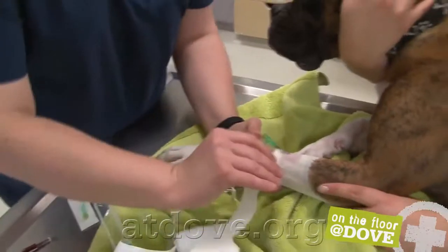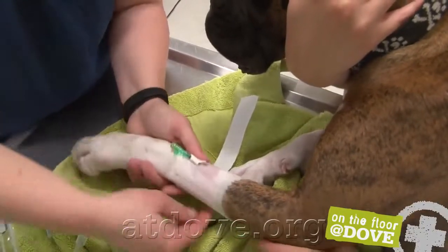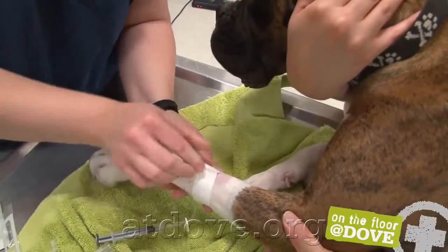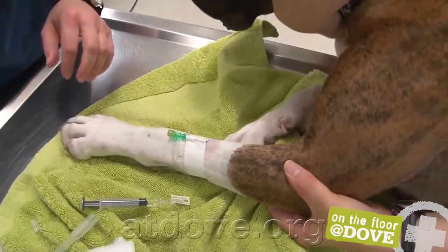Grab my first piece of tape. Wrap this around the hub of the catheter and around the leg. Want to make sure that your tape doesn't get too tight. See a little bit of swelling. Again, I'm going to make sure that that T-set is well seated.